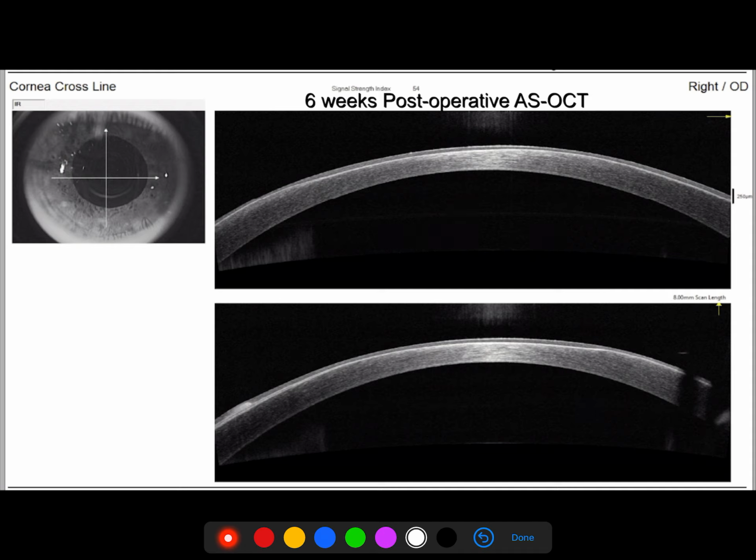Please do not try to do SLET without the amniotic membrane, because it is critical to the success of SLET. However, amniotic membrane by itself is not everything. It is very well documented, and if you read an ophthalmology paper, it says that when the pieces fall off, if the technique is wrong and if you only have the amniotic membrane on the surface, then there is 100% recurrence. So the amniotic membrane itself is not sufficient, but the combination of the limbal transplant and the amniotic membrane is a fantastic combination that gives you excellent, reliable, replicable results.